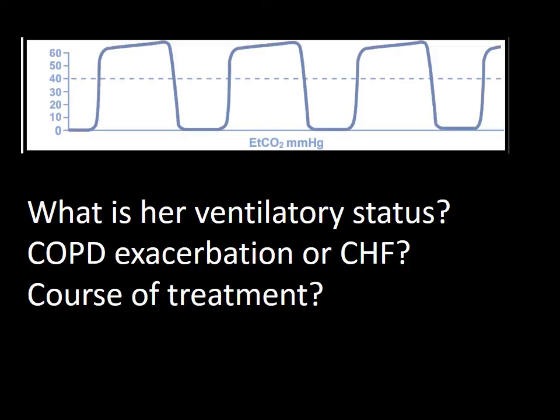And so the question is, is the difficulty breathing caused by COPD, or is it caused by CHF? And remember, if it's COPD exacerbation, we would expect bronchospasms. And we know what bronchospasms look like with a capnography, with a capnogram. We would have shark fin, and we don't have that now. So now we know that it's probably not COPD, it's probably CHF.